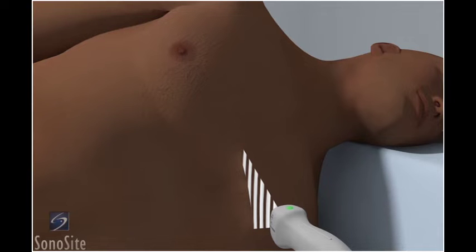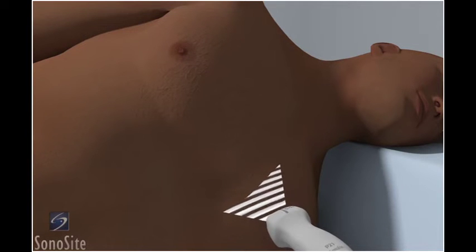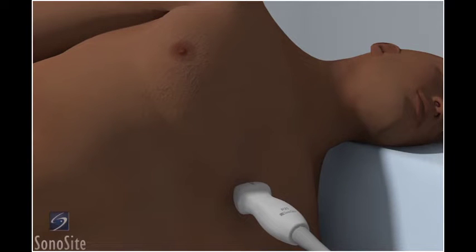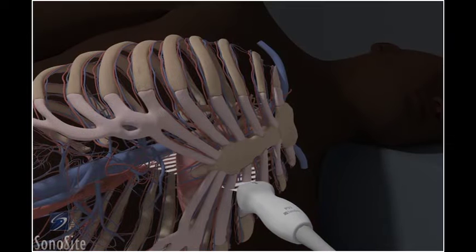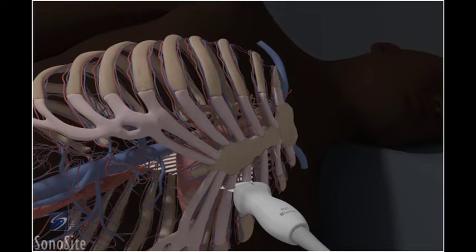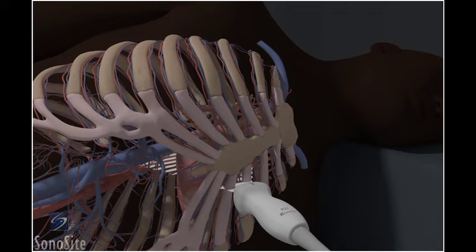Place the transducer at the third or fourth intercostal space immediately left of the sternum. Move between the third and fourth intercostal space and slide the transducer toward and away from the sternum to identify the optimal scanning window.